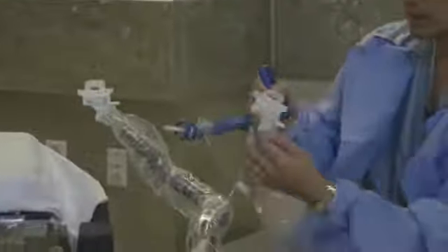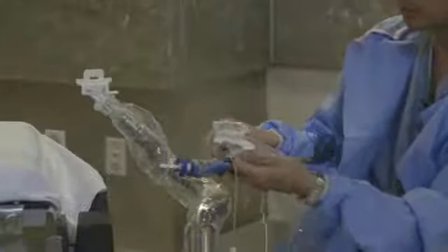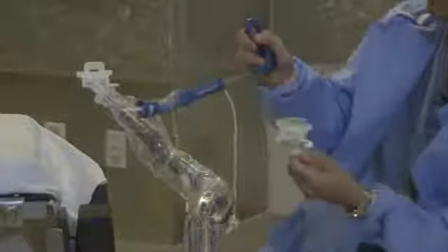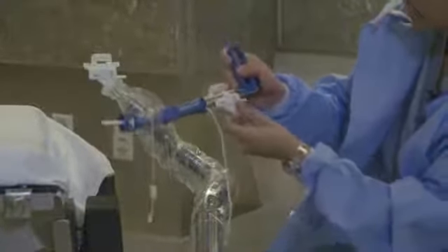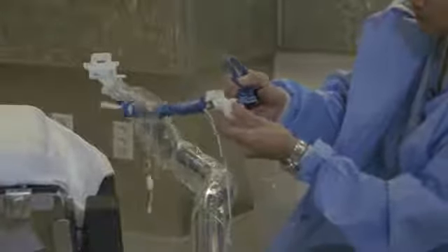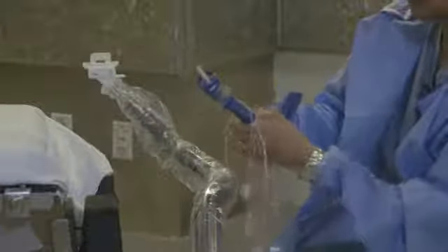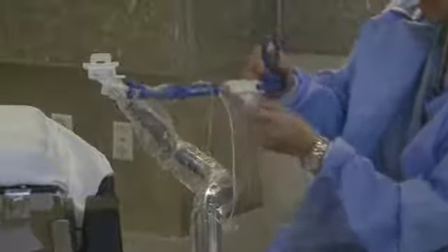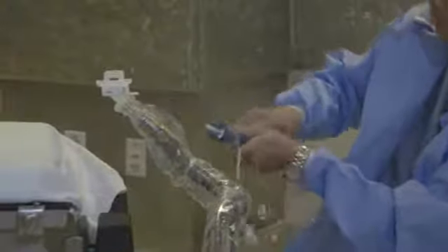So I'm going to show you up close here how that works. And again, it doesn't matter whether the tubing is in the tubing channels or not. I'm just going to move it out of the way just for the sake of demonstration here. But similar to the Advincula Arch handle, there is a place that this will specifically line up. And you can see here, as I lay this in here, you can almost feel like it's going to catch. And then you're going to be able to lock this down, right? So you can hear it clip down, and you know it's locked into place on this handle, right? Again, it has to be oriented in the right location, otherwise you're not going to be able to mount this.